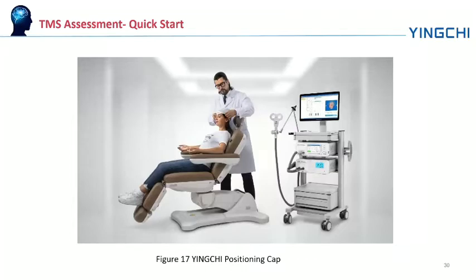So let's have a quick start on determining the MT. Here is a patient wearing a YINGCHI positioning cap.